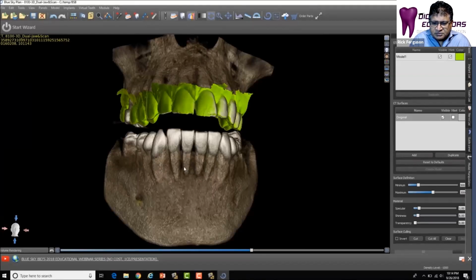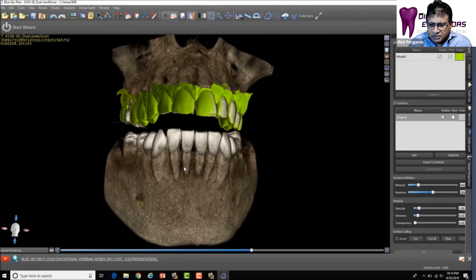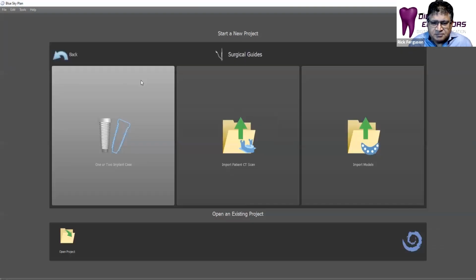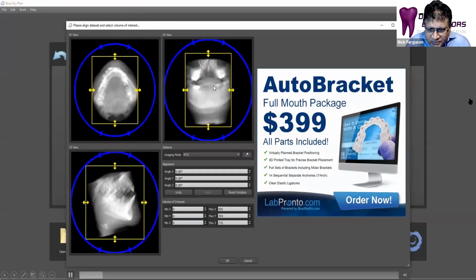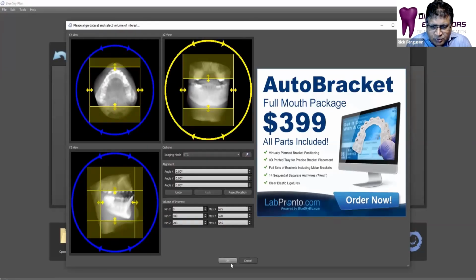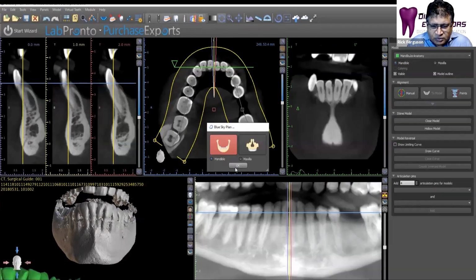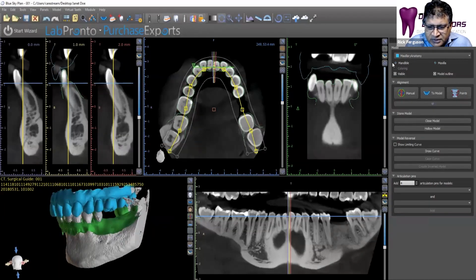With other systems, you would have to import the CBCT and intraoral scans manually into the software and then merge them. They do have automatic merging as well, but you'd have to import the images manually. But still, it's an open platform system, okay? And the next step, of course, after the images are brought in, which I'm showing how to do here with a different CBCT workflow. Of course, the video here is sped up.